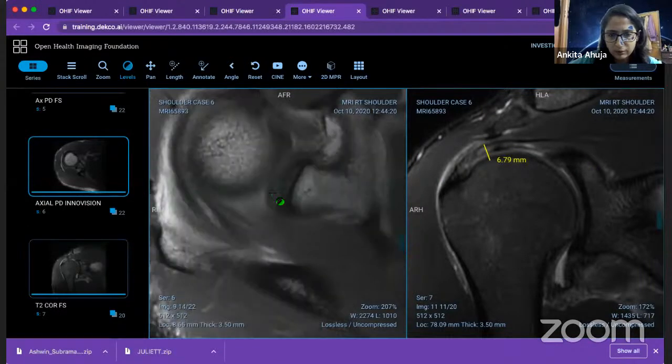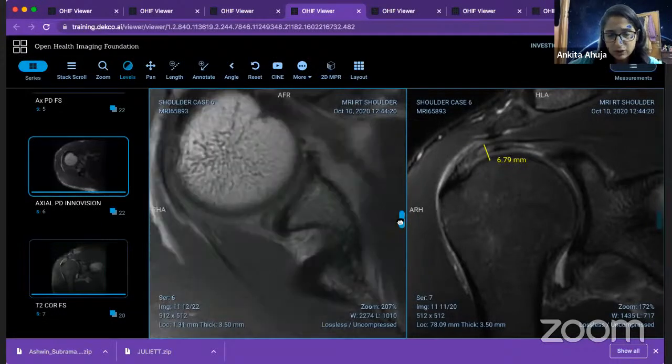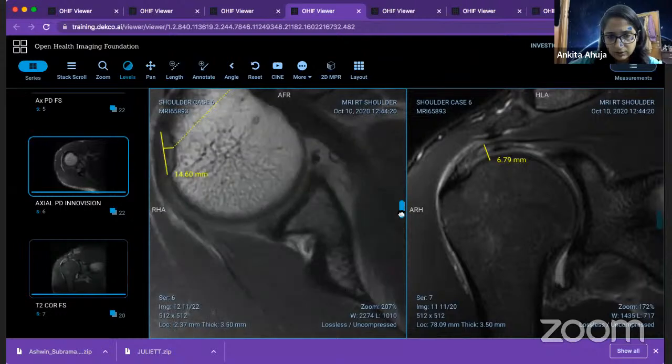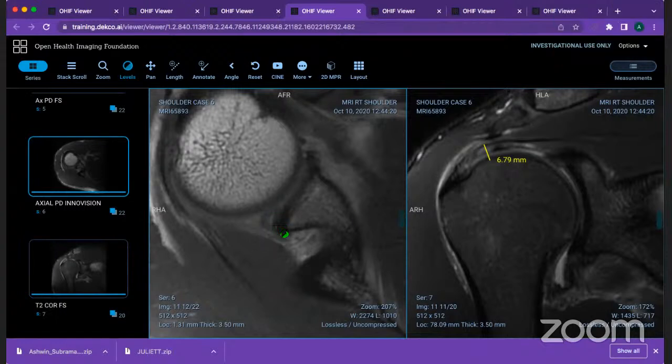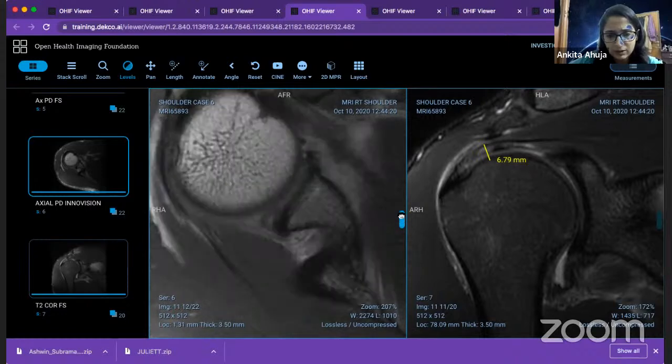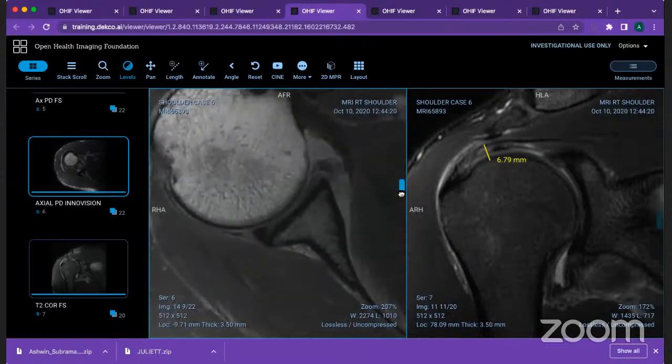Then we move down and focus on the posterior labrum. What do you think is happening to the posterior labrum? Is it looking normal? Posterior, superior. Normal or abnormal? Guys, please, normal or abnormal is not that difficult. Abnormal. You don't see a black triangle, so definitely abnormal. Tell me when you start to see a normal one. So normal. This is in the posterior inferior quadrant.